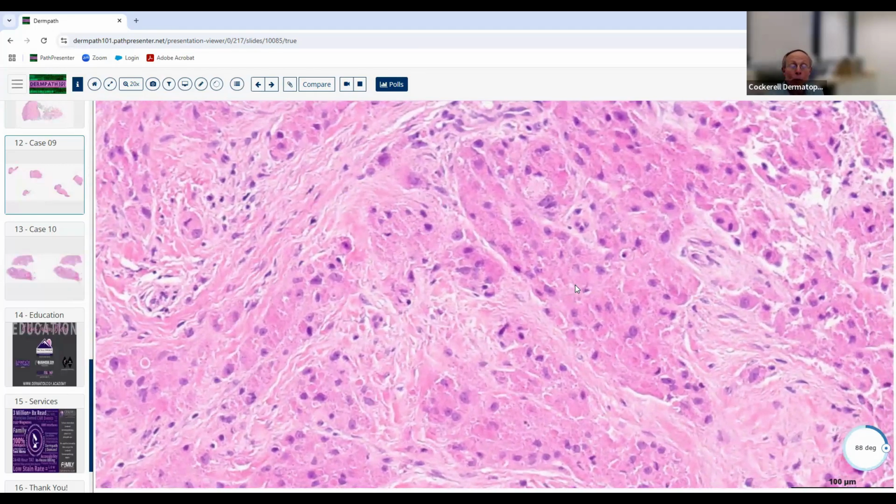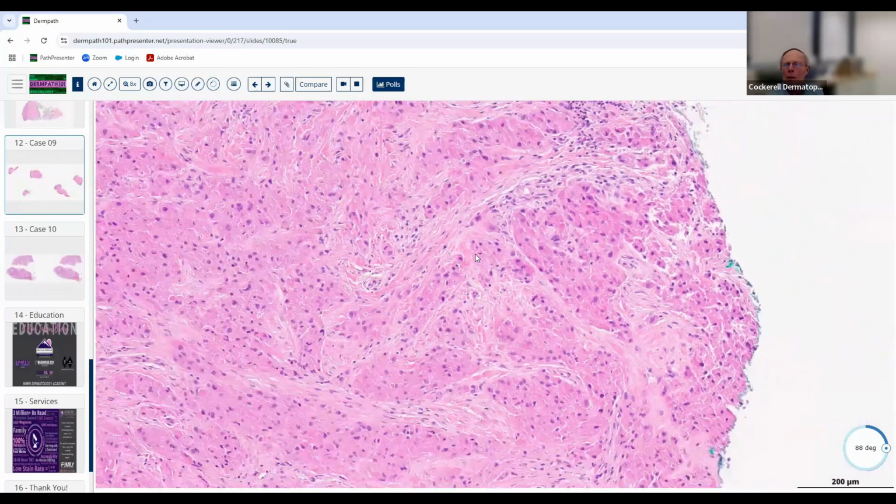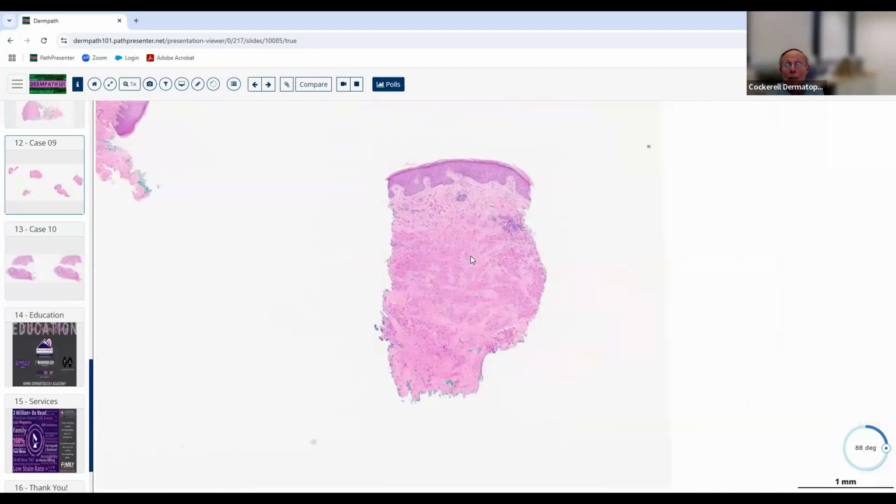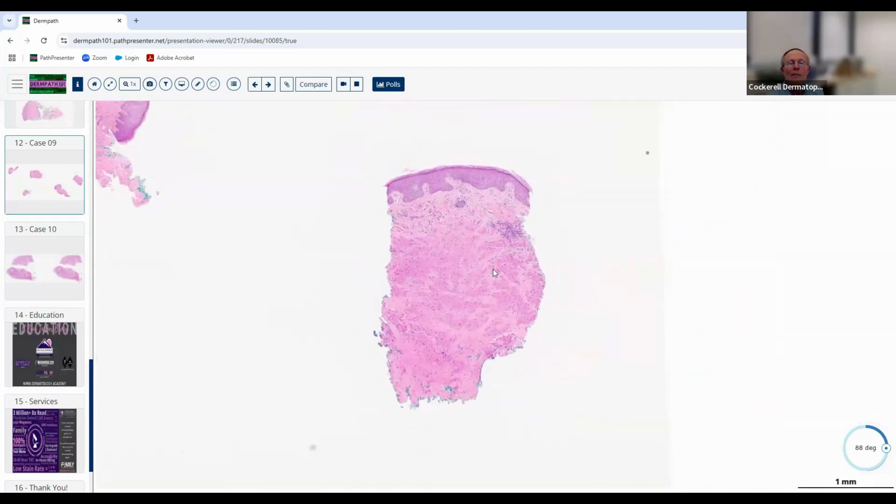granular cell fibrous papule, granular cell leiomyomas. There's a number of different settings where you can see granular cell morphology, granular cell atypical fibroxanthoma, interestingly enough. So you can get granular cell differentiation in certain lesions that are not granular cell tumors also. That's a little sophisticated. They're probably not going to ask you that on the board examination, but they very well could ask you about this entity because it's such a classic clinical presentation.